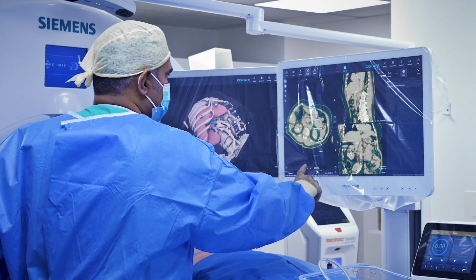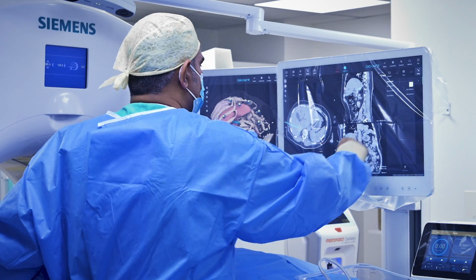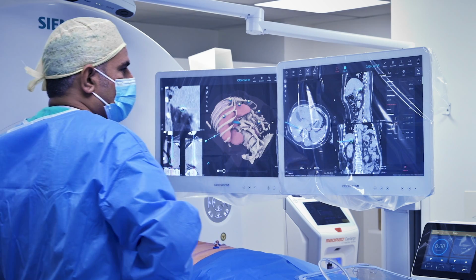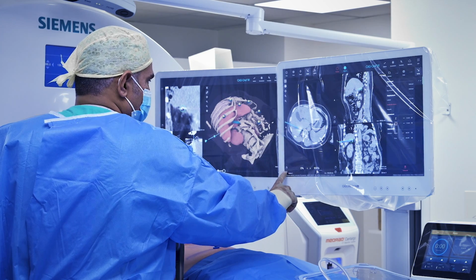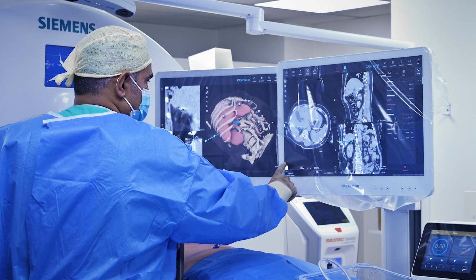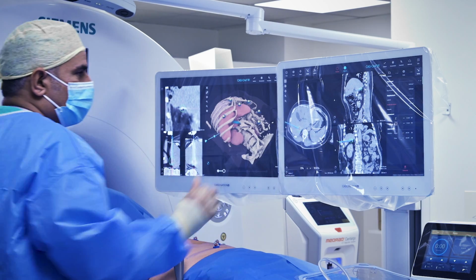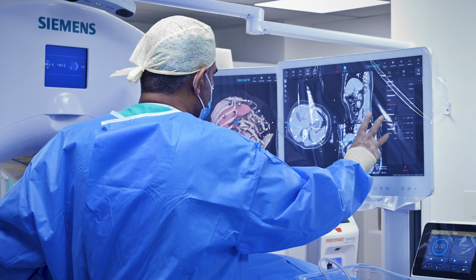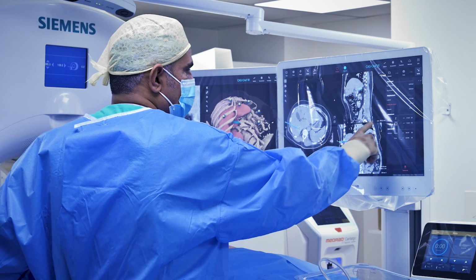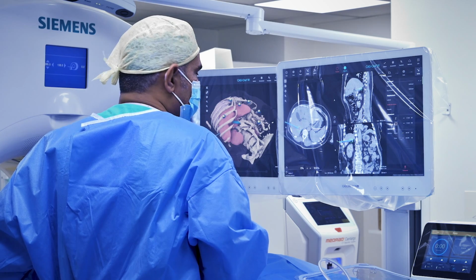So we go to the next one, and we go to verify, and we go to a run detection thing, and we can see that on the latest scan, here is the needle, and it's pretty good, really, when all is said and done. It's close to what we planned, and over here we've got a representation of where we are. It says that our lateral deviation is about 6 millimeters, and you can see that there, and the depth is about 1.5 millimeters too short, so not too bad.